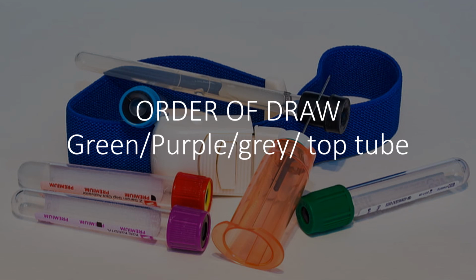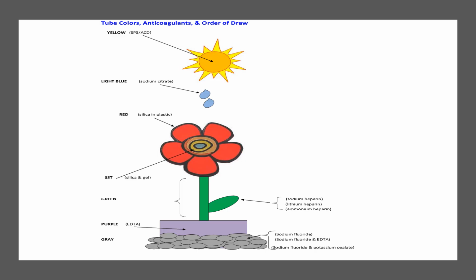So we went through it, right? Blood cultures, yellow, light blue, the coag studies, the raindrops coming out of the sky, right? Then our flower, red petals, the inner is your SST, right? The green stem, then the purple container, the gray rocks, right? So that's how that picture works to help you remember the order of draw, because it's so important. Here's a copy of that picture. You'll have that picture in other places, okay?